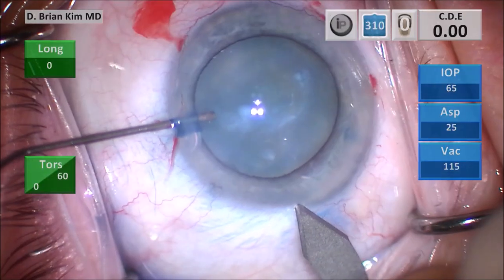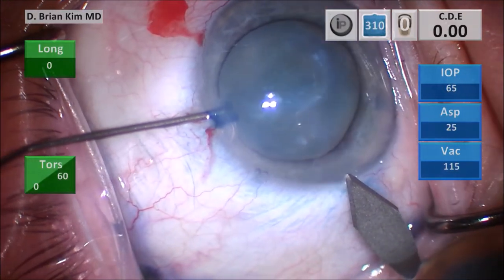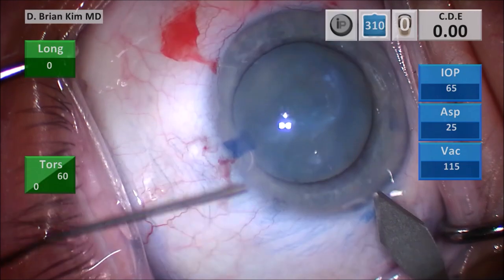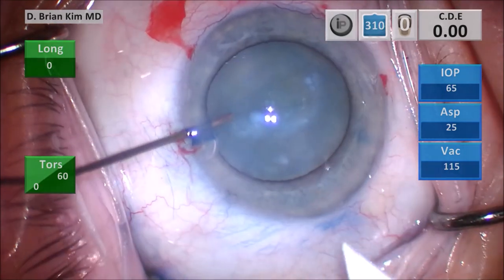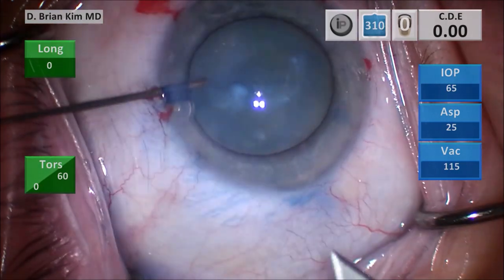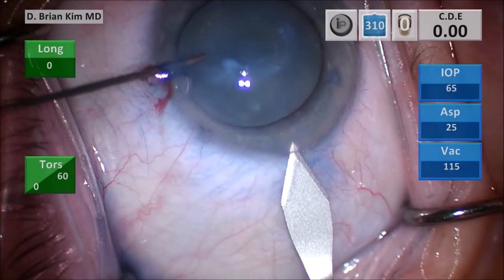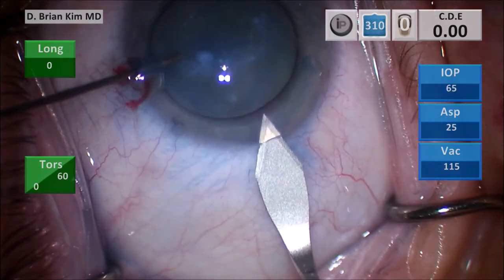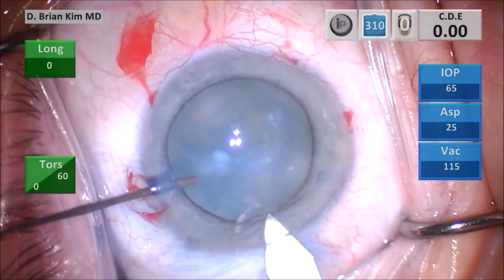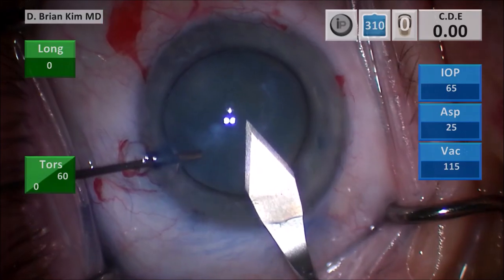Again, I make my vertical groove, but because I am not able to go as deep as I would with the diamond blade, I'm really scoring the surface, and then I'm going to go heel up. I'm going to stab through the stroma through that little incision I made, tunnel with the heel down, tunnel through the stroma, and then heel up, and this is the triplanar corneal incision.